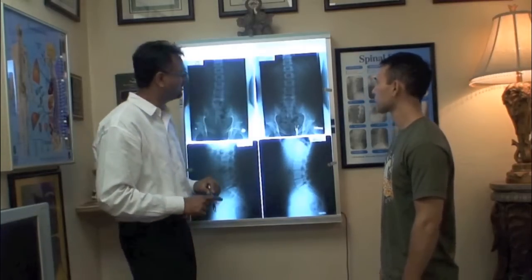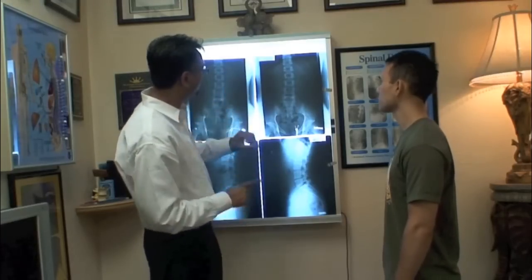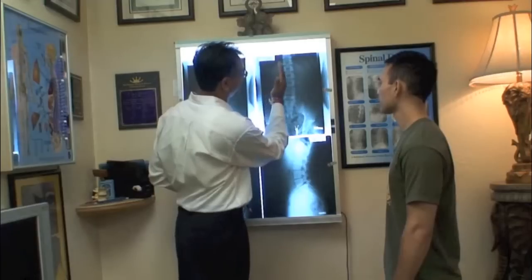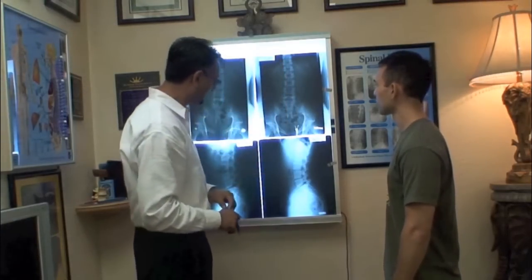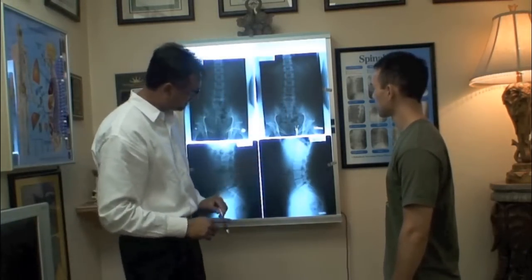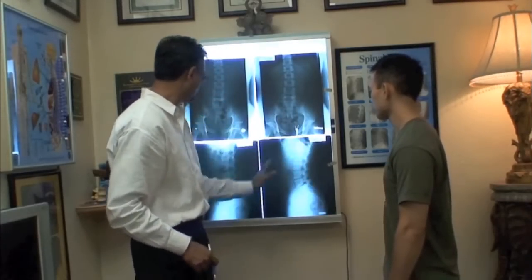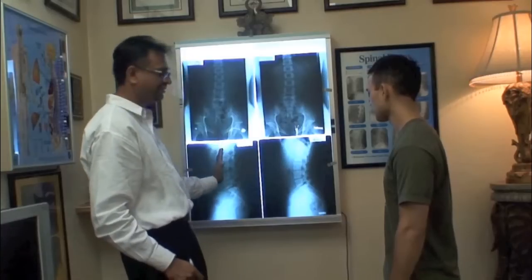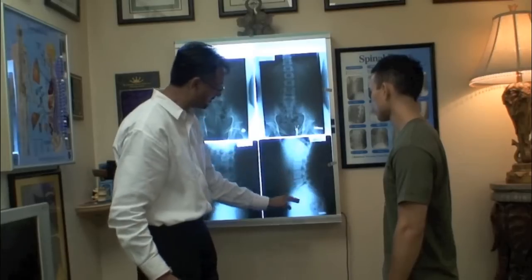When we look at this, this is his recent. Now, we still see a slight curve, but compared to before, it's on the verge of straightening out now, okay? You see the difference? Okay. Now, on the side, here's the vertebrae. There's more of a curvature there compared to here. He was very straight. This one is curving quite a bit.